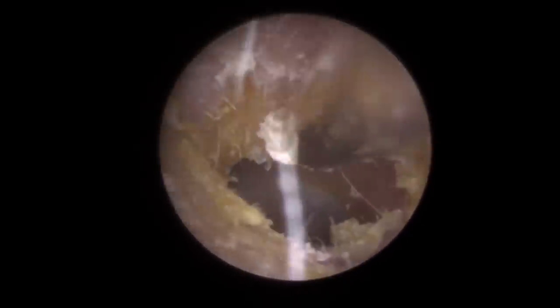If we take a look behind that, you can see we've taken the majority of the wax away. We've got this drier skin debris here — it's quite loose so we'll be able to take this off quite easily. That's a lot better. And then if we go behind that now we can get to this next section, just slowly peeling these little bits down. You can see just how hard that wax is and how well it's attached to the top of the canal. Just trying to get some of these looser bits of wax debris away — you can see that one starting to peel a little bit more across the top.